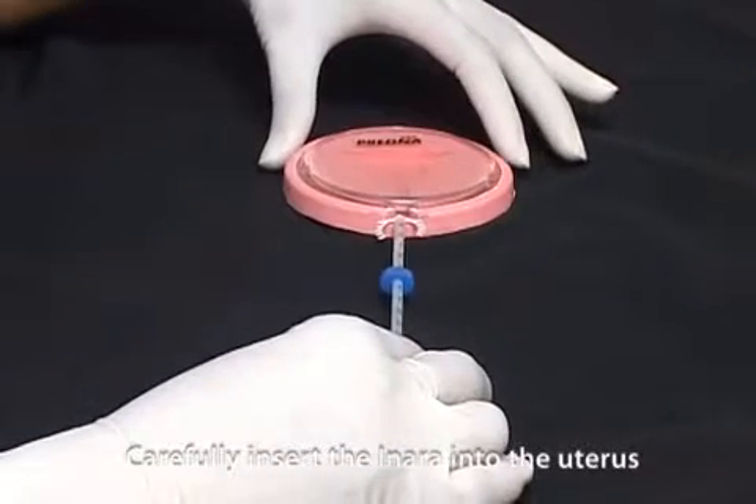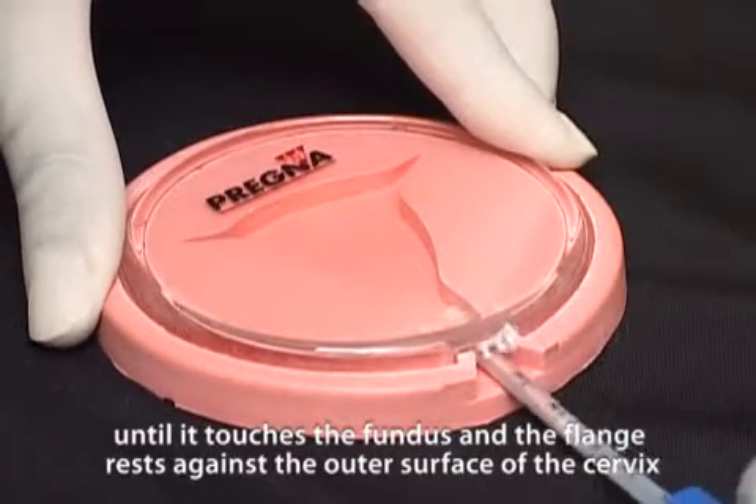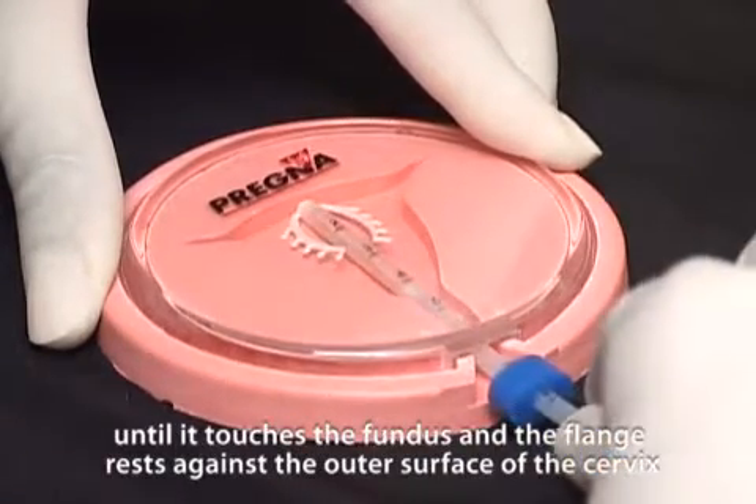Carefully insert the inara into the uterus until it touches the fundus and the flange rests against the outer surface of the cervix.